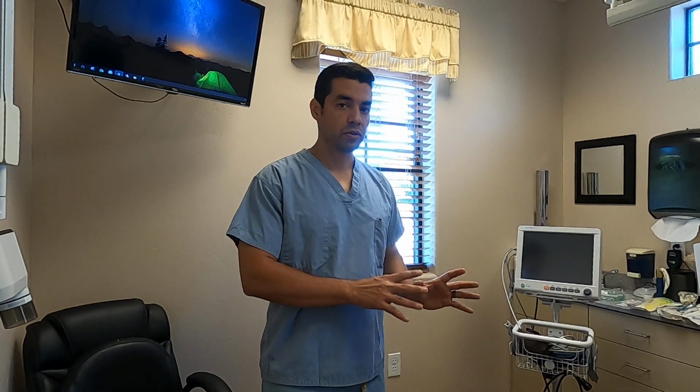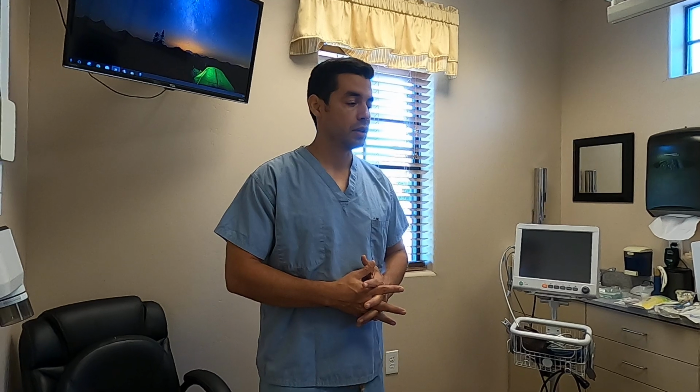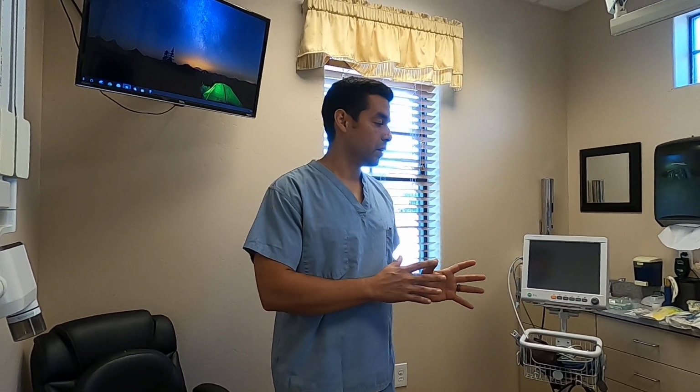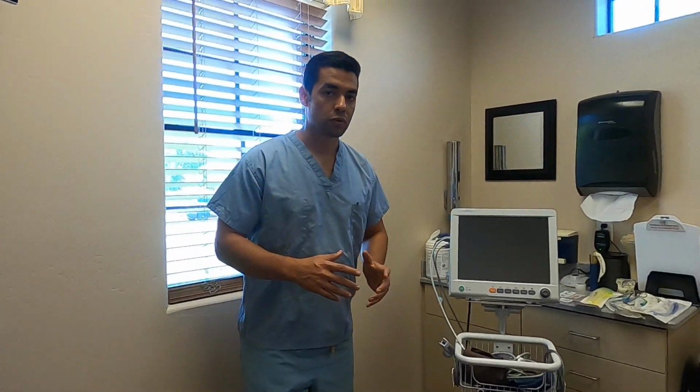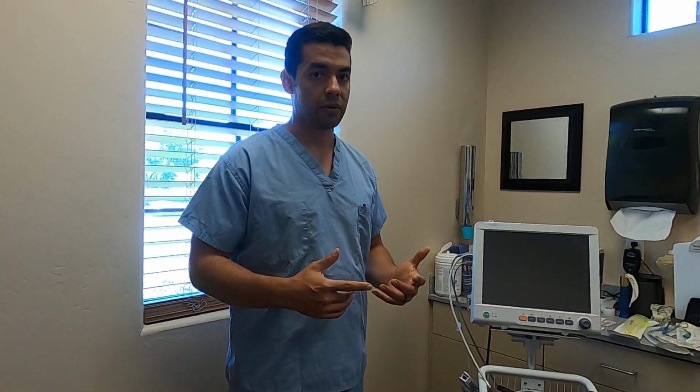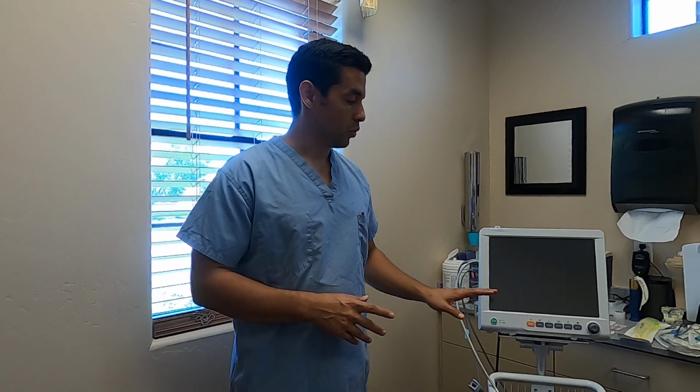When we've confirmed that we're doing the procedure and that we're going to do it with sedation, then we get the patient hooked up to the monitors. One of the reasons why this is important is because we're working to find out if there's anything that might stop the procedure from moving forward. So we turn the monitor on. This is before we've obtained consent, basically, but we've confirmed and we ask them, can I hook you up to the monitor? We're going to take some vitals and then we're going to get consent.